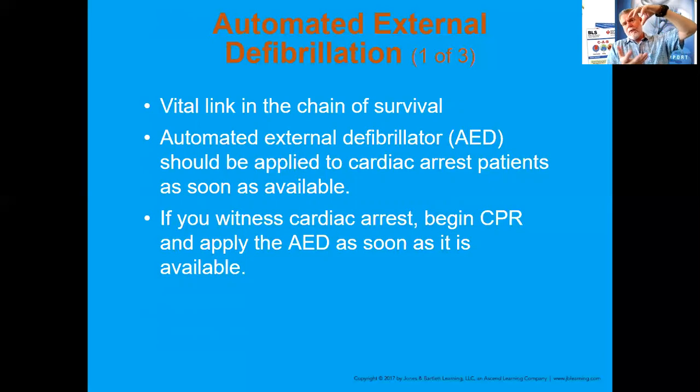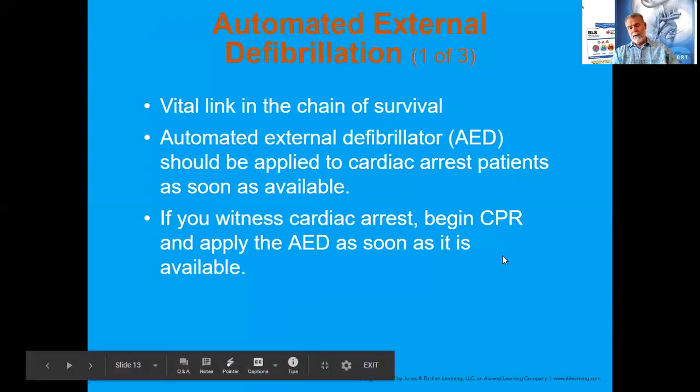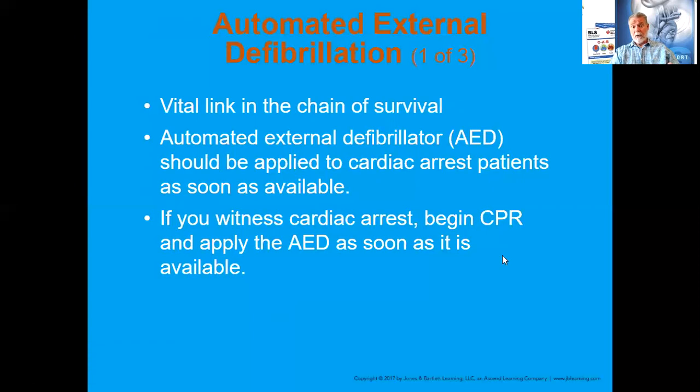Those are all times when the bottom part of the heart, the ventricles, are beating really fast or just beating out of control. That's fibrillation. And there's no atrial involvement, so there's no pushing and subsequently pumping of blood throughout the heart. So we do want to get the AED there as quickly as we can. It can restore the regular cycle and eliminate that abnormal heart rhythm. Two great things about the AED.